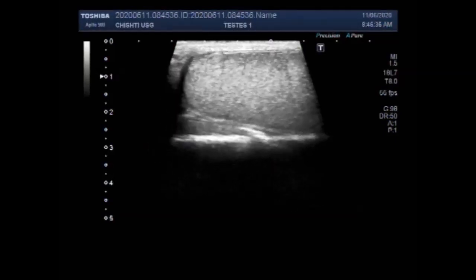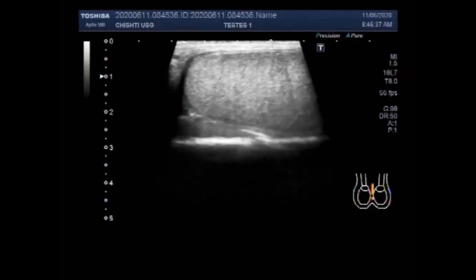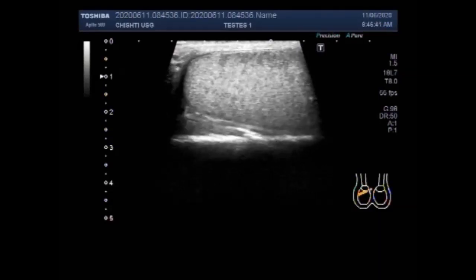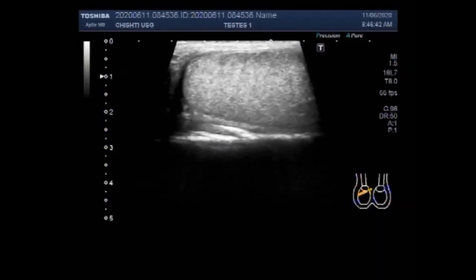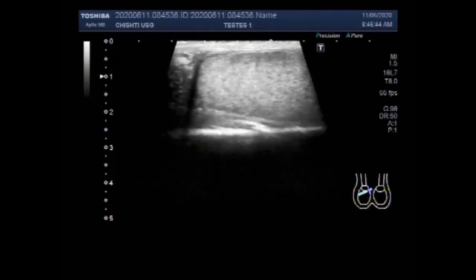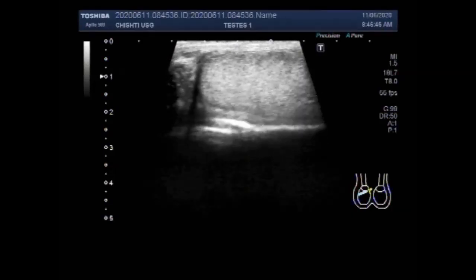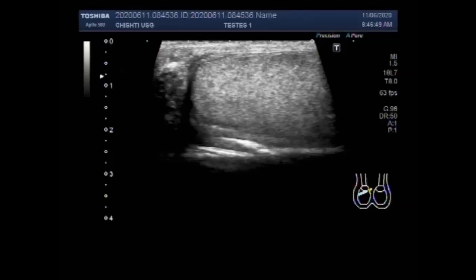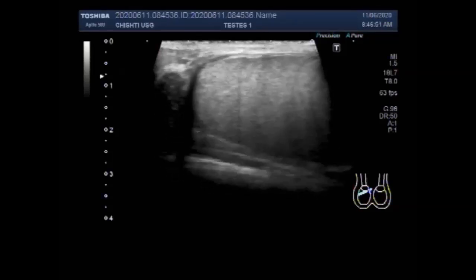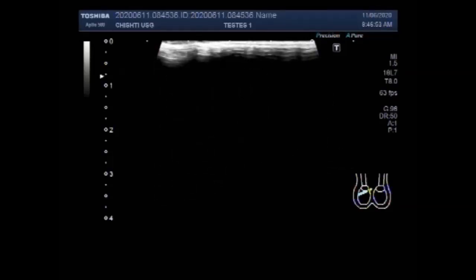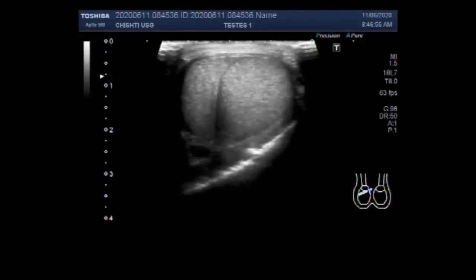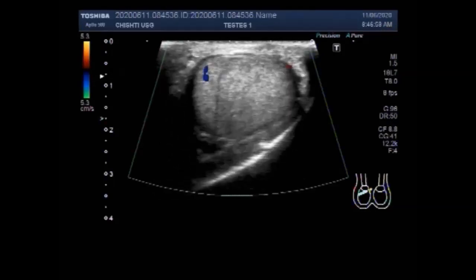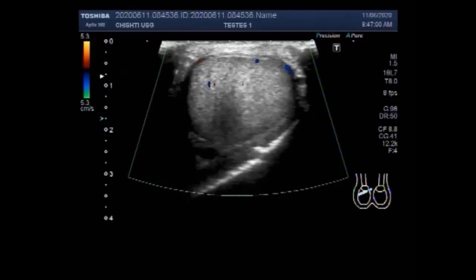Dear viewers, I hope you are all fine. This ultrasound video shows a scrotal hydrocele piocele. The purulent fluid collection generally arises from communication between the infected testicle or testicular abscess and an existing hydrocele through the mesothelial lining of the tunica vaginalis.